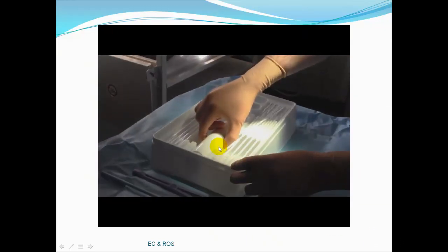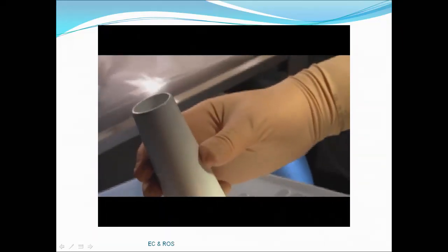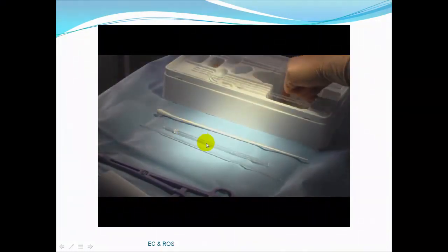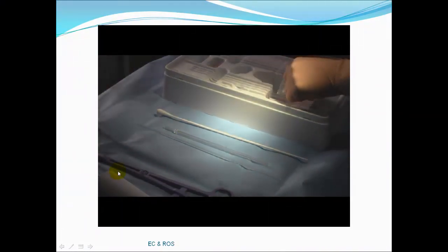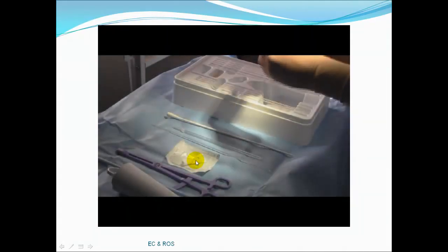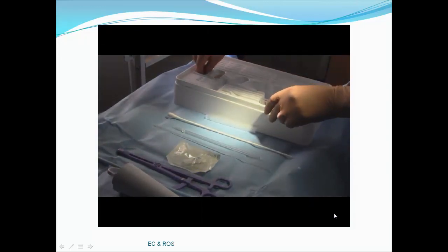The amnioscope with obturator in situ. Note, laid out, the tube holder for the preheparinized capillary tubes. And on the left hand side of the screen, the holder for swabs used for cleaning the fetal head. There is also a small tube containing soft white paraffin. Now, attach the blade to the top of its holder.